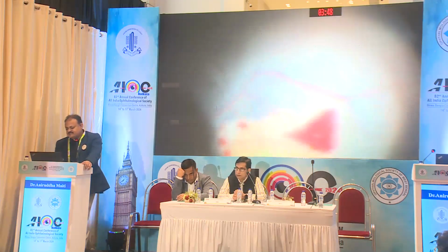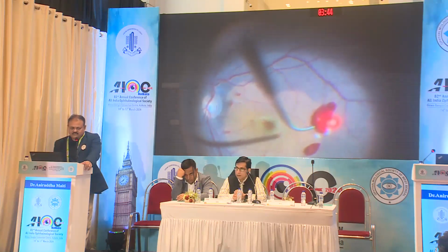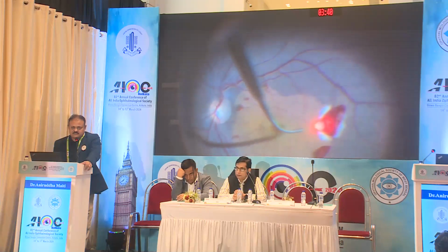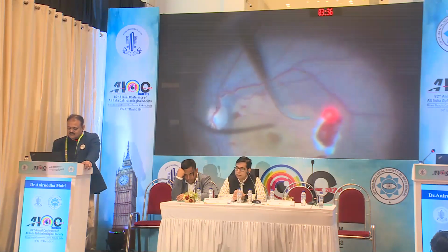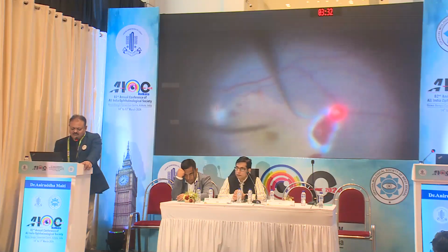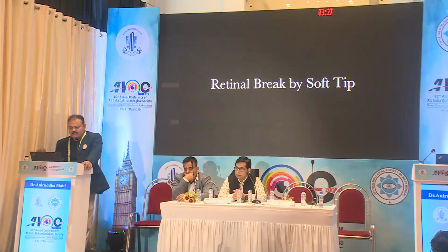This kind of break actually can be left because in the posterior pole it doesn't make any difference. But if you feel that it is a full thickness one, do a laser, because otherwise there is absolutely no prognosis for this patient. But this kind of break can be left behind. But we need to be very careful and very sure about the aim of the eye.